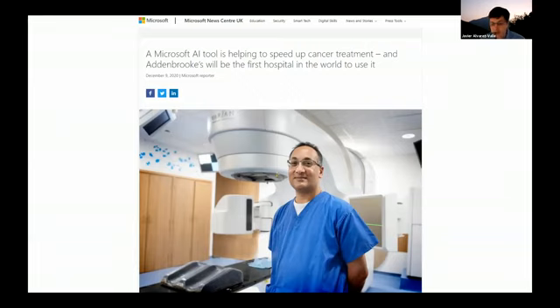So we announced last December that because we are open sourcing all our code, Addenbrooke's is going to retrain the models using their data in their own Azure subscription. And they are going to go through clinical validation and create a quality management system to put this into clinical use. So we have been evaluating this for 3 years already with them in research evaluation, and they now want to move it to clinical use.